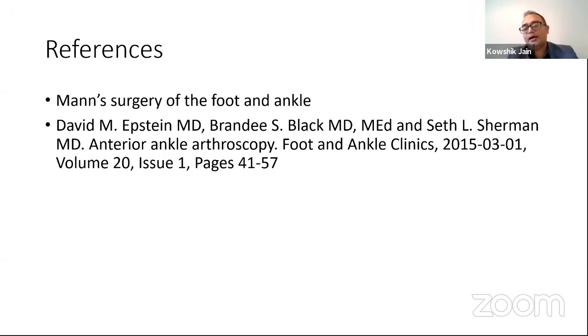In the past, that was the norm, say over 2 decades ago. But if a center doesn't have a non-invasive ankle distractor, that is the next best thing to do. Put a calcaneal pin and distract it. You will be able to distract the ankle.